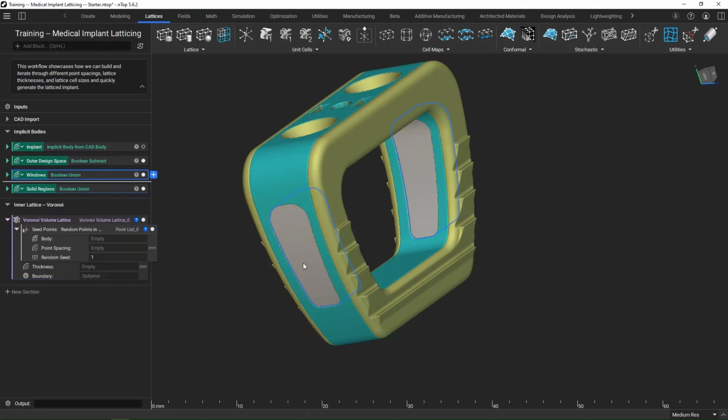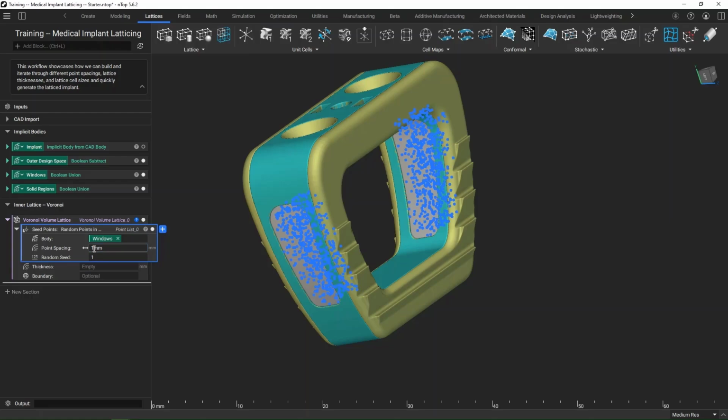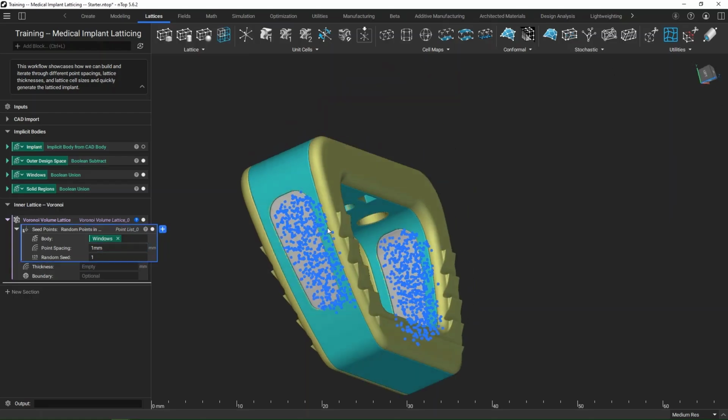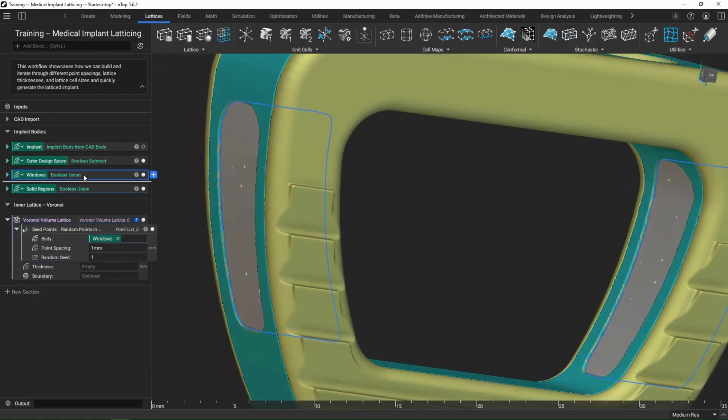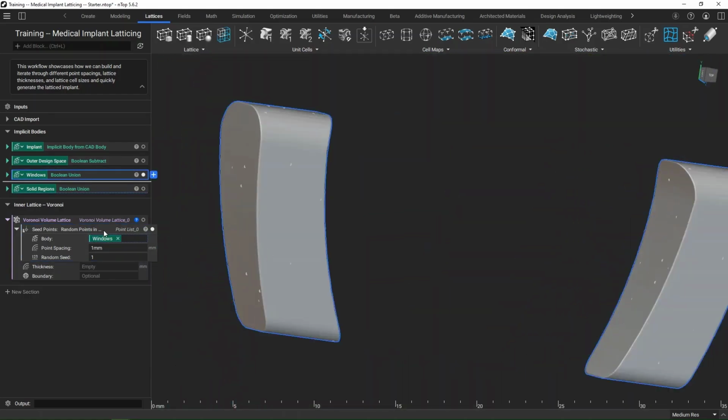As we know, we want to fill those windows, so I can just drag and drop that input here. Point spacing. So this is going to be how far away those seed points are going to be. I'll just start with 1 millimeter point spacing. We can kind of see what that looks like. As you can see, they're highlighted here. And basically let's go ahead, isolate these 2 views.